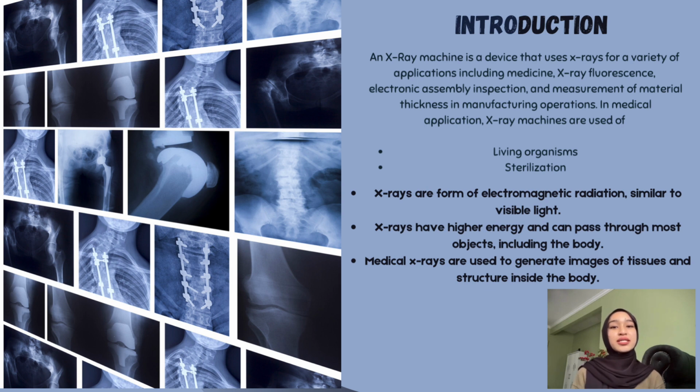An X-ray machine is a device that uses X-rays for a variety of applications including medical imaging, X-ray fluorescence, electronic assembly inspection, and measurement of material thickness in manufacturing operations. In medical applications, X-ray machines are used by radiographers to acquire X-ray images of the internal structure of living organisms, and also in sterilization.